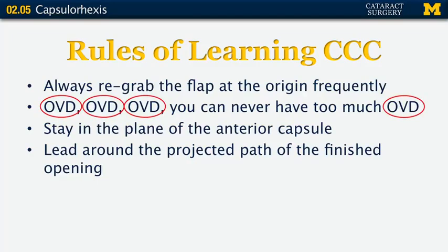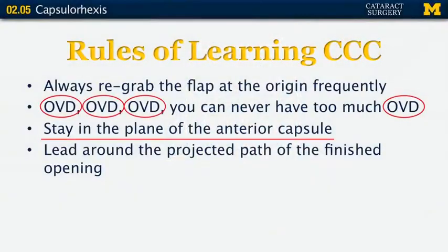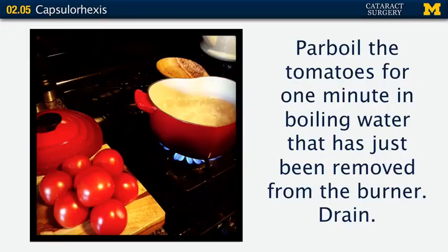Always use lots of OVD — you can never have too much. OVD helps keep the lens and capsule pushed back and flat, and it helps you control your flap. Don't be afraid to stop even after you've just started the capsulorhexis and add more viscoelastic. Stay in the plane of the anterior capsule — don't lift up on your flap. If you lift up, you're more likely to go radial. Lead the tear around the projected pathway of the finished opening.